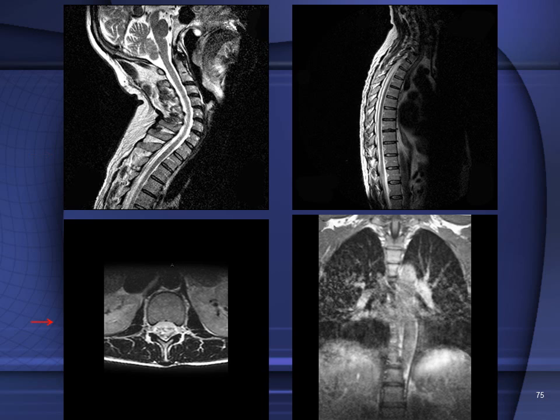In this image below, we have a transverse or axial section at the lumbar level. We can identify this because of the wide vertebral body. These are the erector spinae musculature.